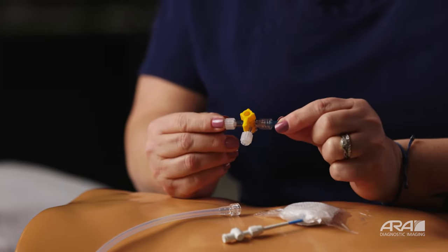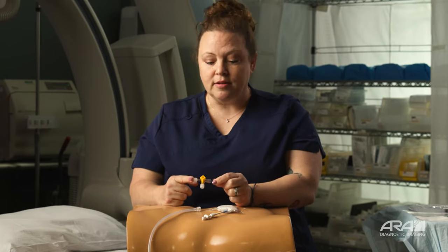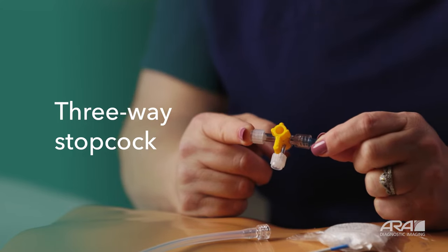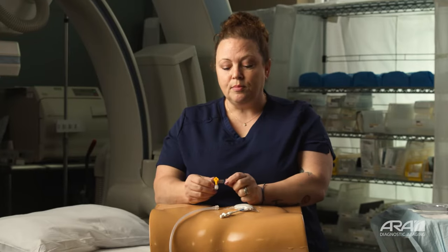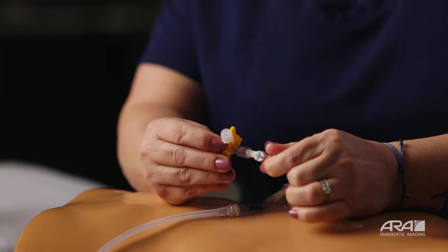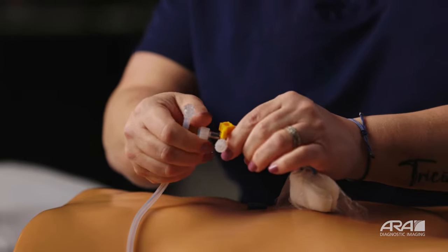Let's talk about a piece of equipment that you may have gone home with that looks a little intimidating. You may have gone home with this piece of equipment between your drain and your catheter tubing. This is called a three-way stopcock. The more you use this and the more comfortable you become with this piece of equipment, the easier it is going to be for you to use. Doctors typically place this connected to the drain, and the other side connects to your catheter tubing.